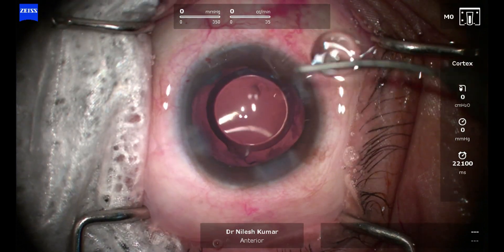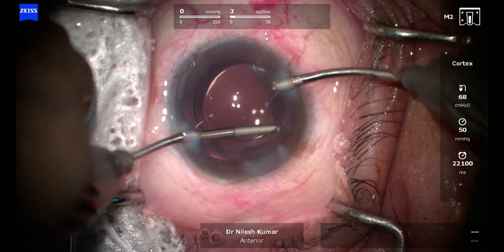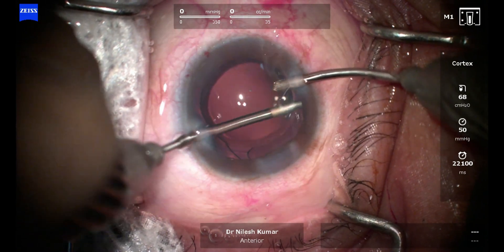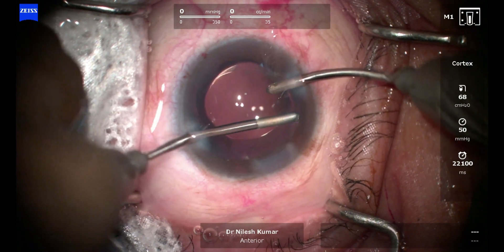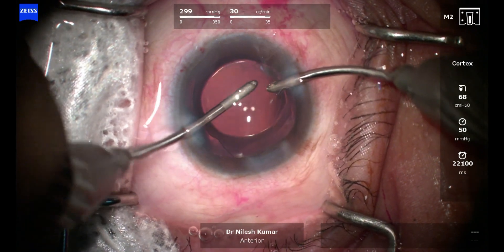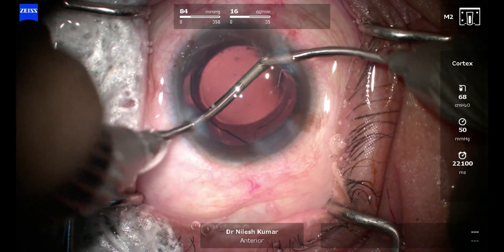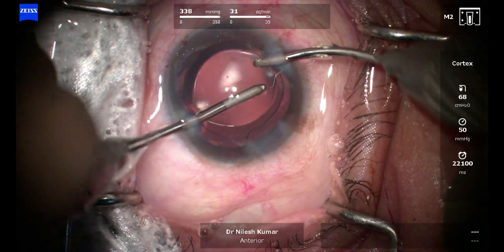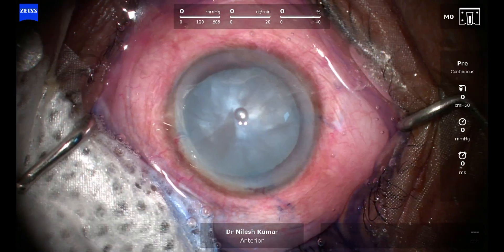Almost all cases that I have done have been like this. At the end you can see that perfect capsular rhexis, and the IOL is centered beautifully. We just have some amount of cortical fibers in the periphery that I am pulling out in capsular polishing mode, and now you can see it's a perfect case that can be closed with good vision expected tomorrow.